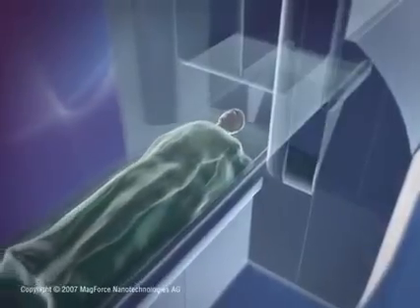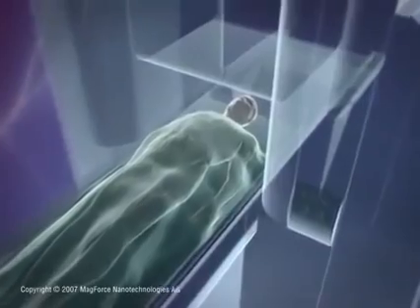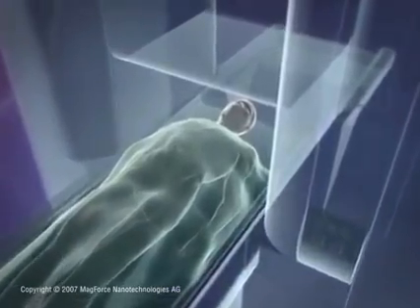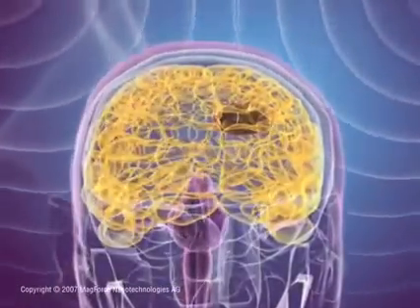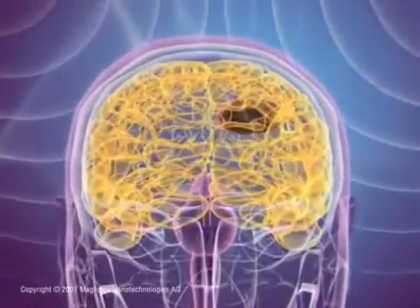The patient now enters the therapy device in which an alternating magnetic field is produced which is of no danger to humans. This field affects a 100,000 times alternation of the magnetic poles within the particles per second, creating warmth which is precisely regulated from outside.